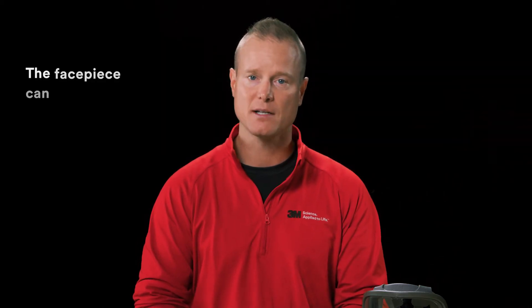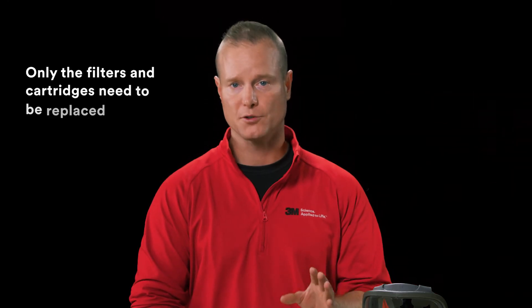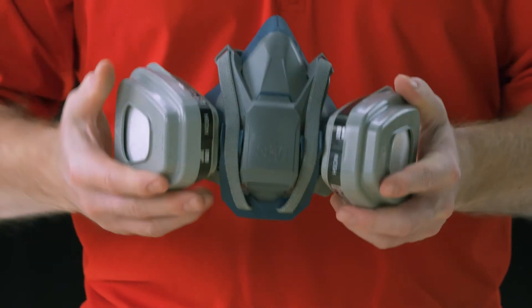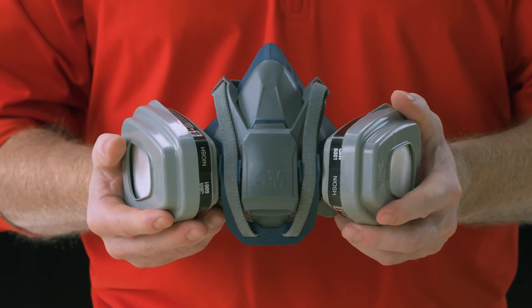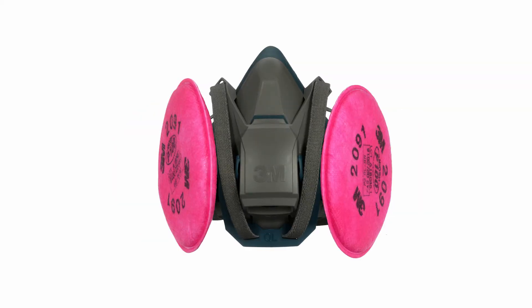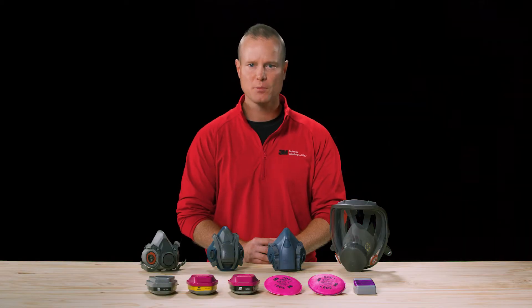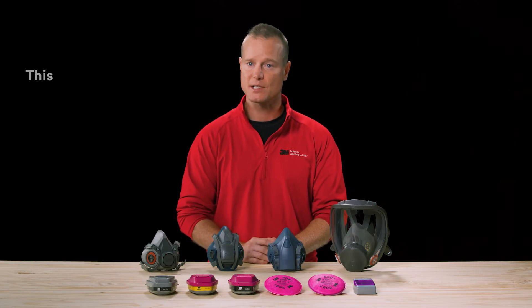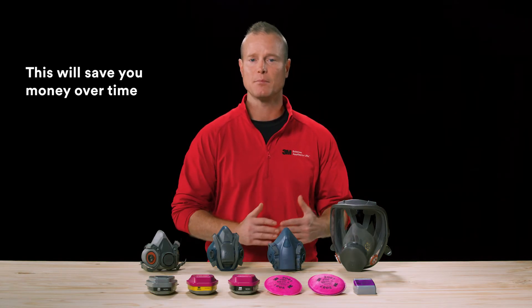Reusable respirators can also be more cost effective over time than using disposable respirators. This is because the face piece can be reused while only the filters and cartridges need to be replaced. When you select a respirator with a universal cartridge and filter attachment system, you can change the cartridges or filters based on the application and hazards in your work environment. That's what makes reusable respirators so adaptable. Once the cartridges or filters have met their service life, you simply replace them with new ones. This will save you money over time because you don't have to buy new face pieces.